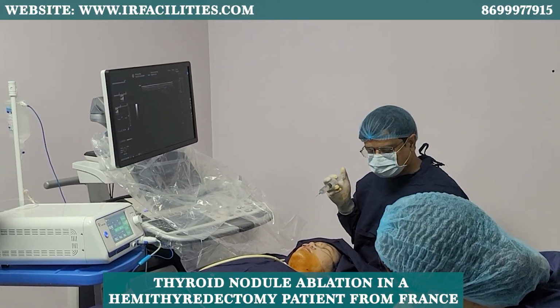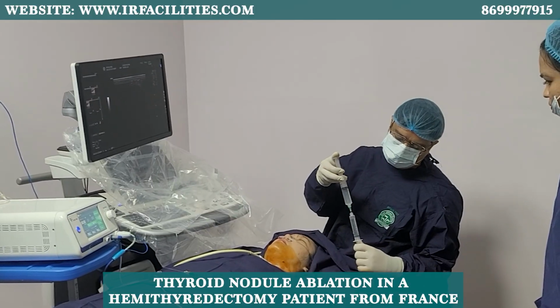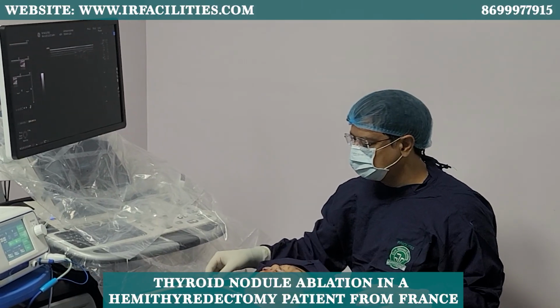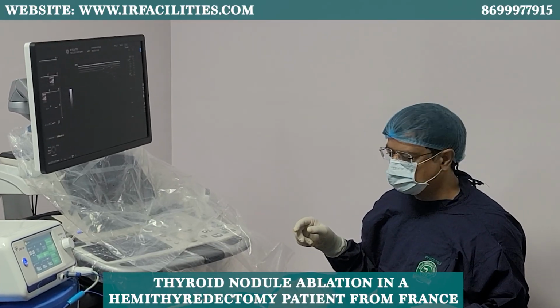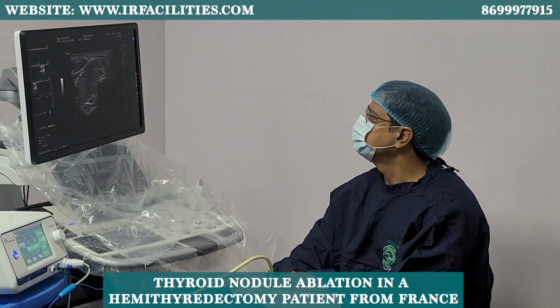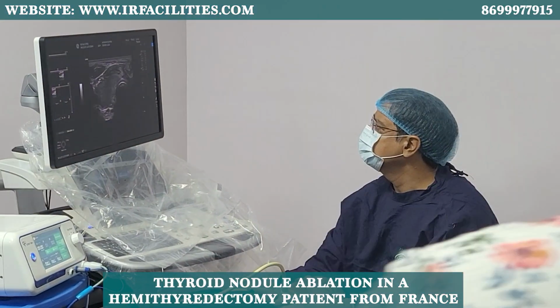So what I'm going to do is put some fluid. I'll make a fluid collar around her. The needle I was looking for. So what I'm going to do is I'll go through the thyroid.